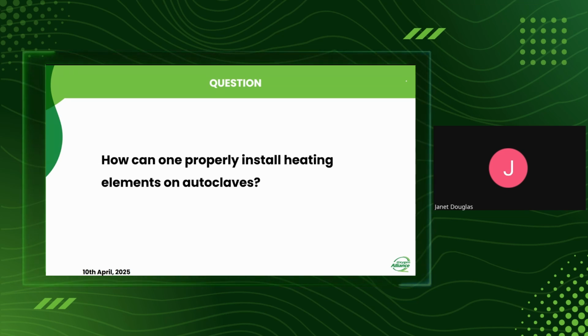Continue, Daniel. The issue of connecting the electric heating element in a machine: if a set means one holder inside with two elements, you can connect one to live and the other to neutral. If one set has three elements, you connect line one to supply one element, line two to supply another, and line three to supply the third. The neutrals, you short them together. That means you balance the three lines.